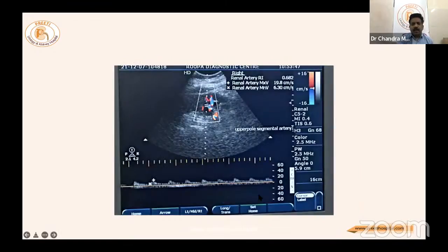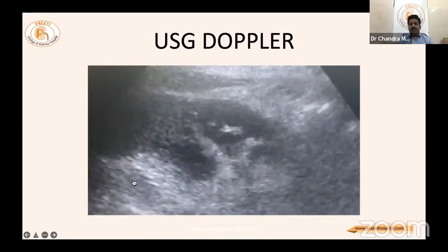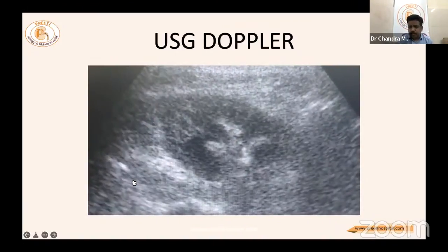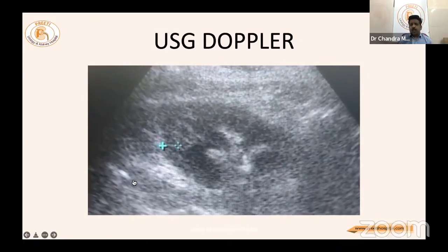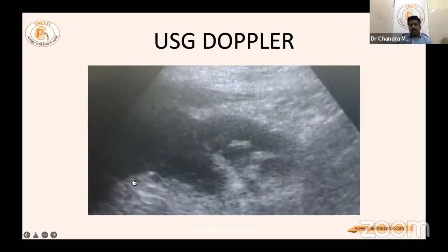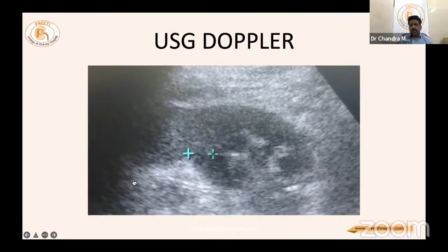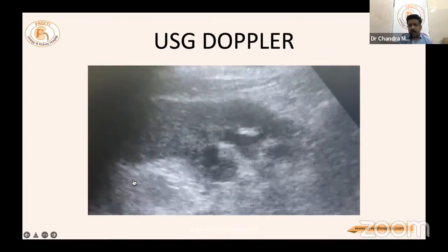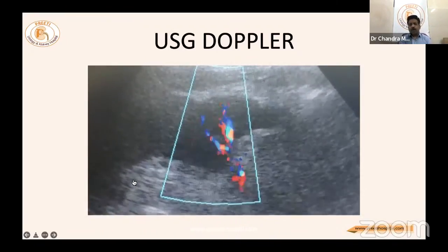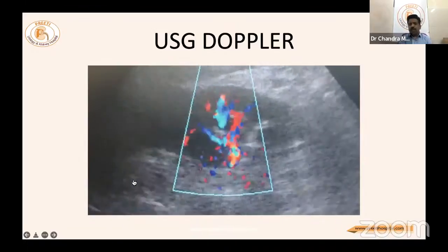The next-day renal Doppler is always performed, as bedside equipment and a radiologist are available. The Doppler video shows nice parenchyma with corticomedullary differentiation, kidney size approximately six centimeters, no cyst seen, and good cortical thickness of approximately 1.5 centimeters. Most importantly, Doppler shows upper pole vessels nicely supplying with low resistive index, indicating a viable kidney.